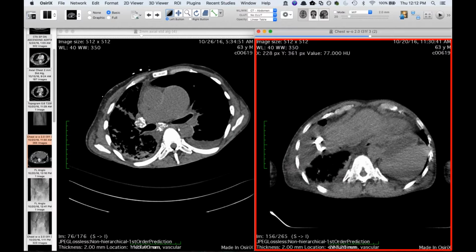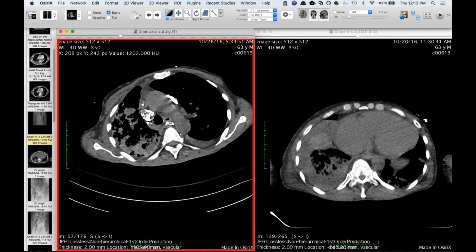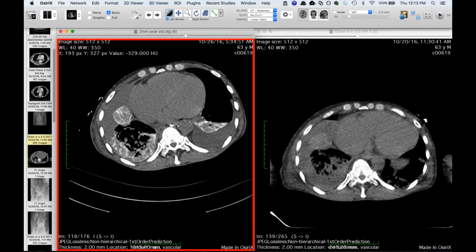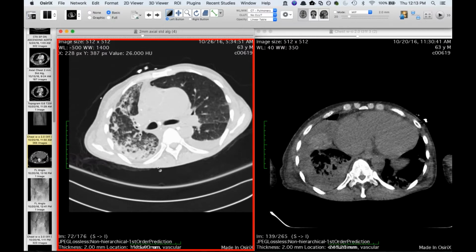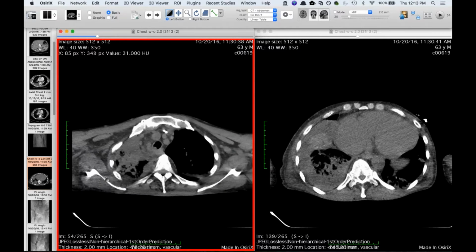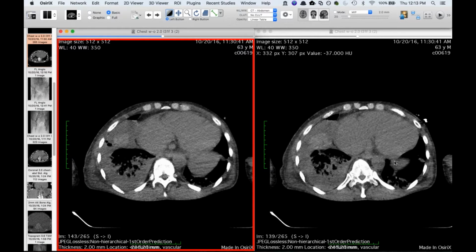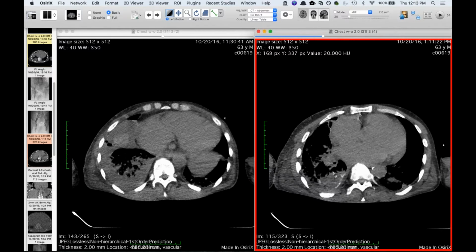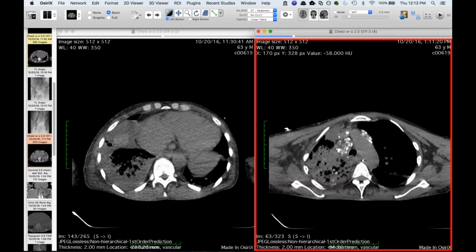small effusion. But they went in and did a lymphangiogram and injected Lipiodol into his thoracic duct, and it ended up extending into his lymph nodes, and then the Lipiodol ended up in his lungs, presumably in the lymphatics of his lung, because this is the time course during the procedure. So this was at the beginning of the lymphangiogram. There's not really anything in there. And then this is a couple hours later, as you can see it in the thoracic duct and in this area, and now the lung is all hyperattenuation, and it continued to worsen over the course of a few days.